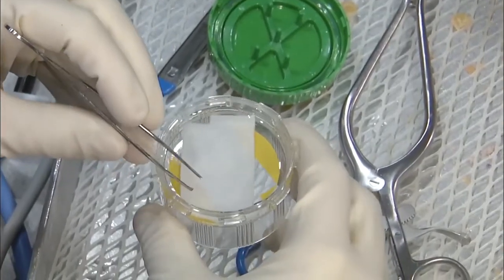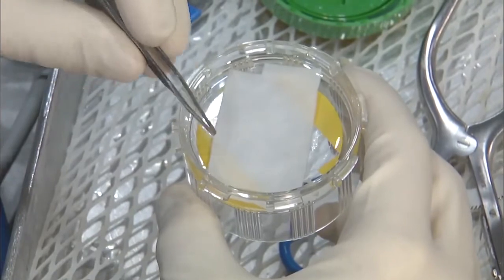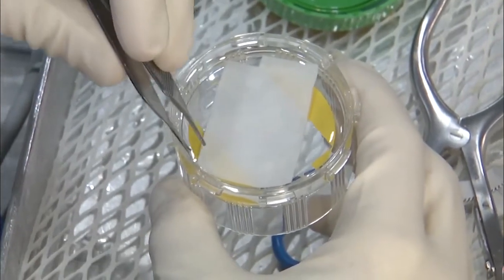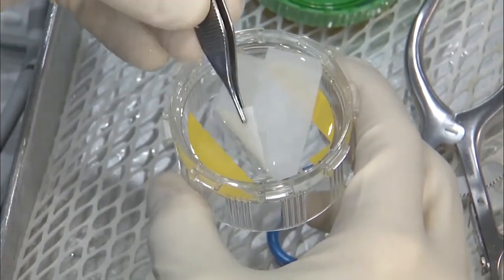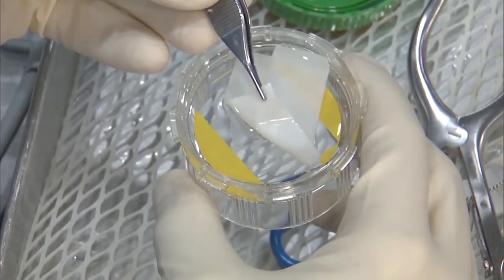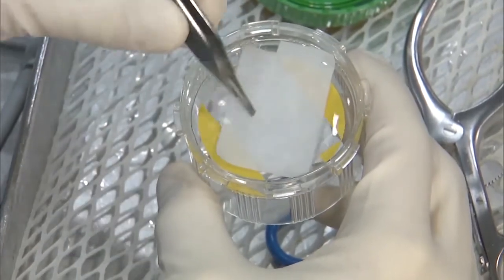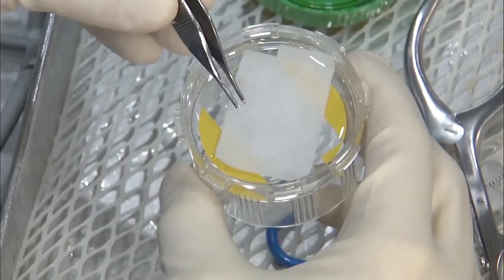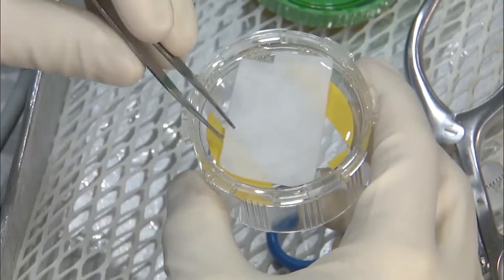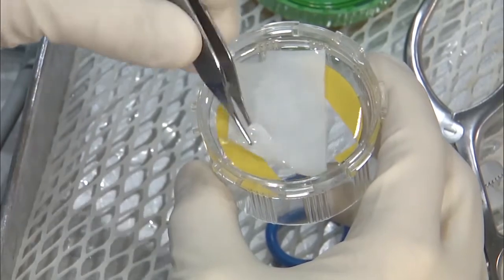That's the part where the cells are actually adhered to. And the cells, there's 500,000 cells per centimeter squared of the patch. And then on the top side, this is the shiny side, that provides a smooth articulating surface. So your cell side will go down to the bone to integrate both horizontally and vertically, and then the shiny side goes up towards the joint surface.